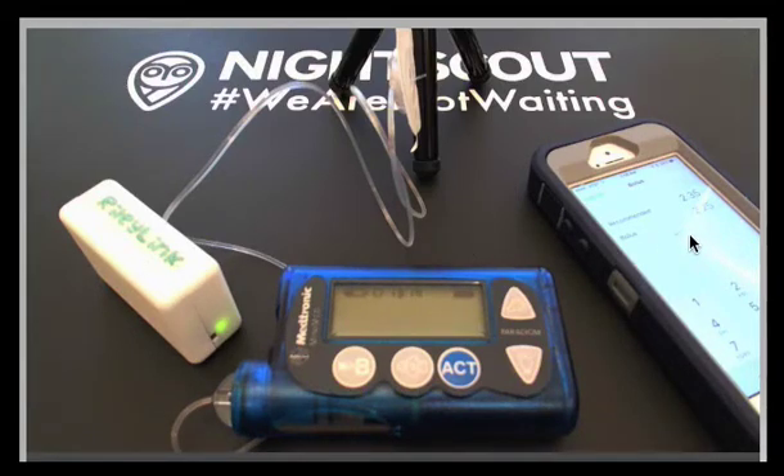The Riley Link is communicating with the iPhone. We're now set up to do a bolus, and if everything works according to plan, you will see it dripping out here.